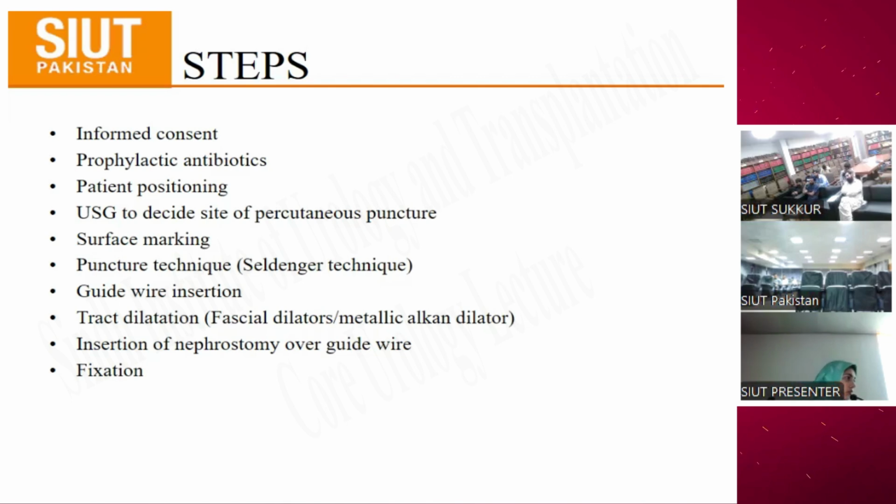Then you remove the plunger, and through the back end of the needle you place in a guide wire. Now the guide wire has two ends. You have to tell us which end you want to place in, the floppy end or the straight end, right? If nobody is going to tell us all these things, then I'm sorry, it's not a technique. A technique has to be something related to SOP, standard operating procedure.